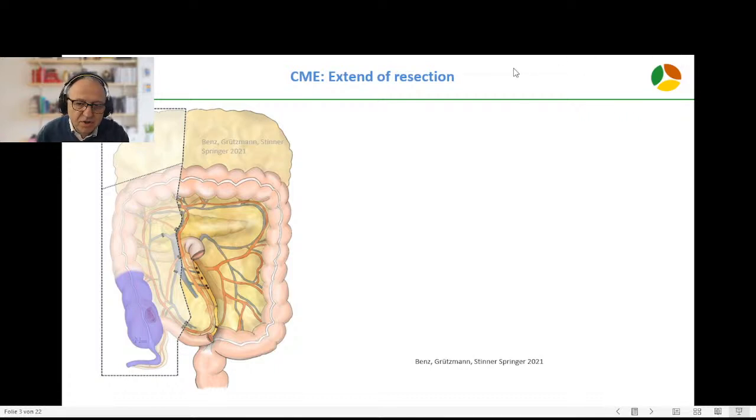The extent of CME resection is shown on this slide, described by Hohenberger in 2009. The whole mesocolon should be excised for that kind of tumor just down to the mesenteric vessels, taking all the lymphatic tissue on block of the mesenteric root up to the pancreas. They're dividing the right branch of the middle colic artery, dividing the superior right colic vein, and then removing the whole thing on block.